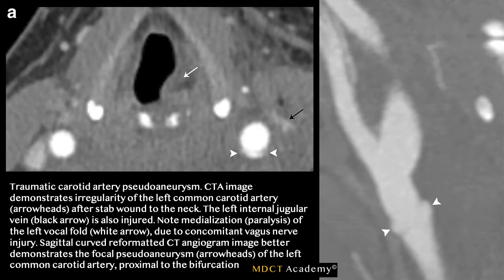Image A demonstrates a traumatic carotid artery pseudo-aneurysm. This shows irregularity of the left common carotid artery, indicated by two white arrowheads, after a stab wound to the neck. The left internal jugular vein, shown by the thin black arrow, was also injured. Note the paralysis of the left vocal cord, shown by the white arrow, due to vagus nerve injury. On the sagittal curved reconstruction, you can see the pseudo-aneurysm inferiorly with two white arrowheads — a bulge coming out without involving the entire vessel.